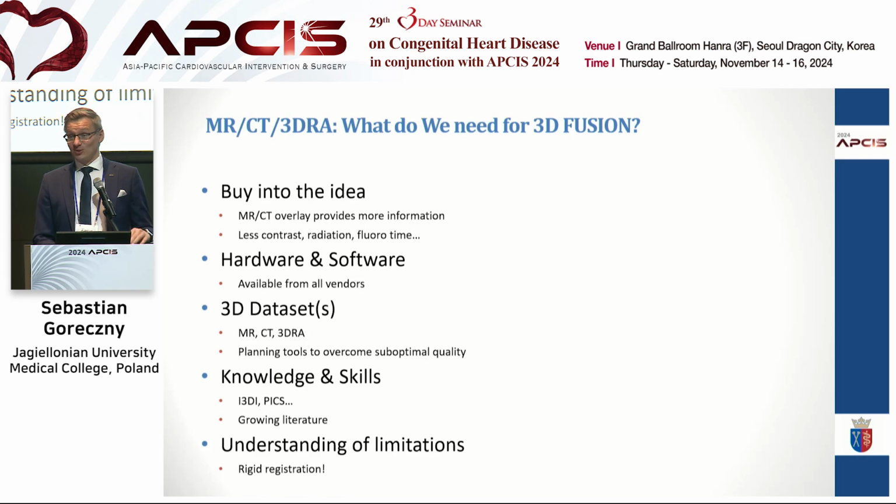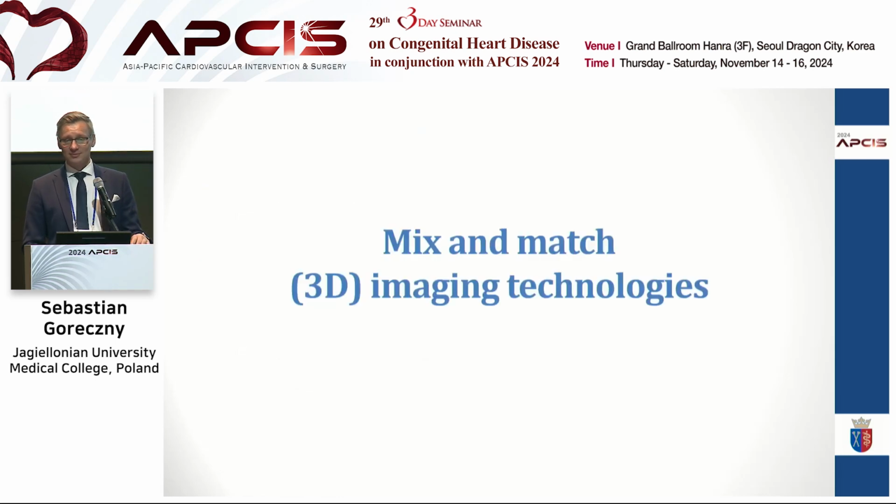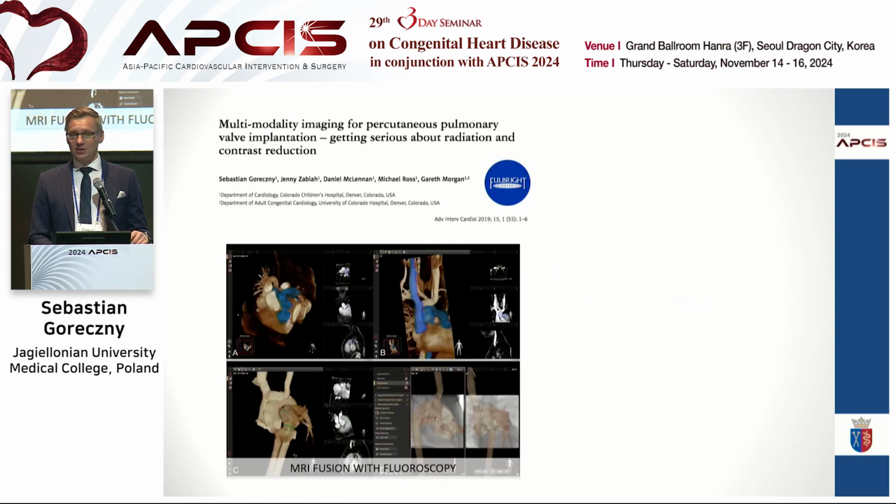If you have mastered all that, let's take it to another level. Okay, so bear with me for a couple more examples. And I would highly encourage you to mix and match 3D imaging technologies. And I'm sure that in all your hospitals, you do have several to choose from. So you can fuse not only 3D with 2D on the table, but you can use different imaging technologies.